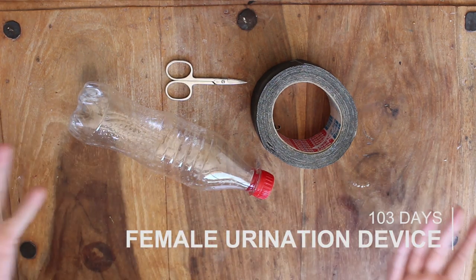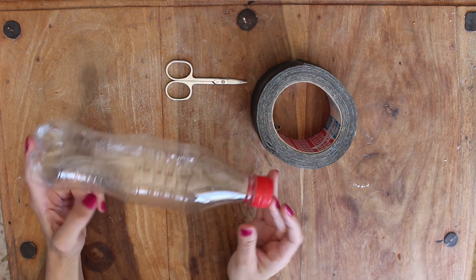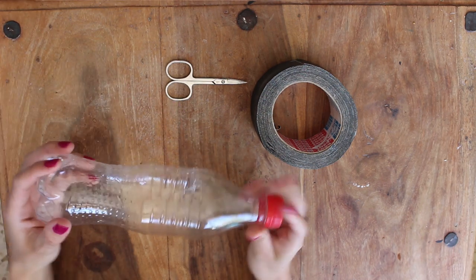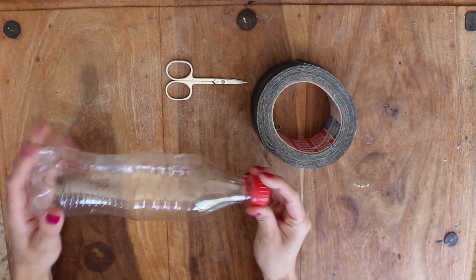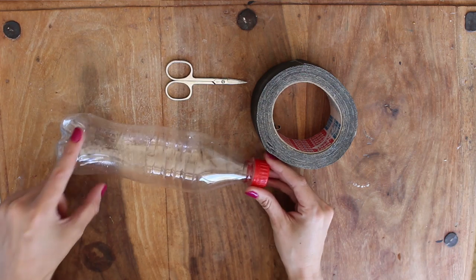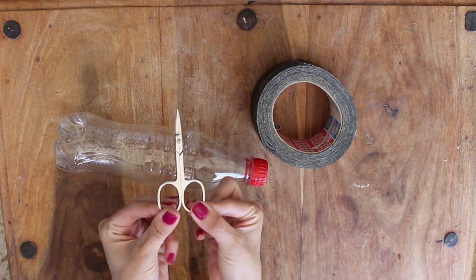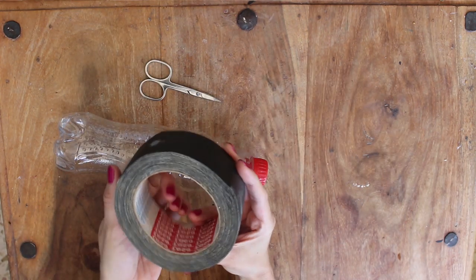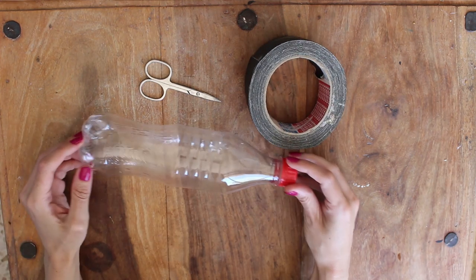Today we're gonna make a female urination device. You're gonna need a bottle — this is a small Coke bottle, and it's great because it's got a dip in it and a quite thin top with a small hole at the end. You don't want one with a huge hole at the end. You also need some scissors or a cutting device, and some tape — this is gaffer tape, it's great for making these.